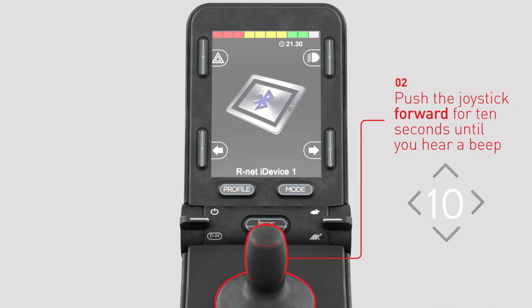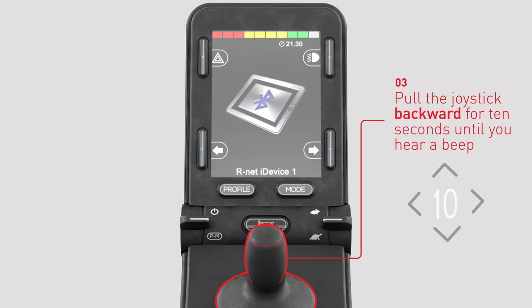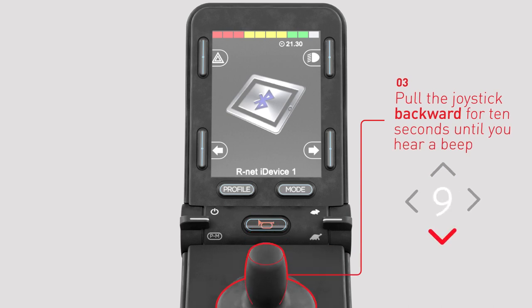To place R-Net in discoverable mode, push the joystick forwards for 10 seconds until a short beep is heard and then release. Then pull the joystick backwards for 10 seconds until a short beep is heard and then release.